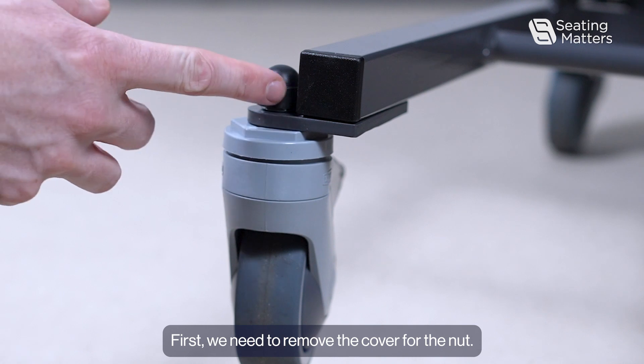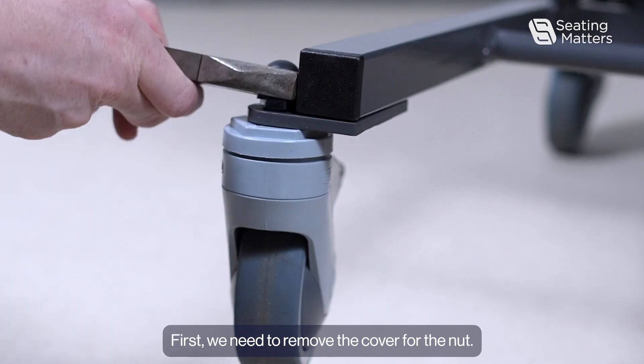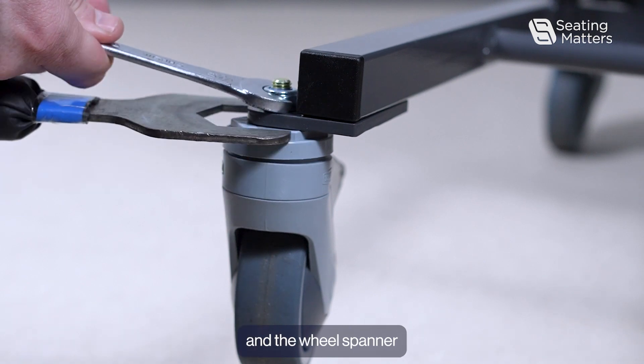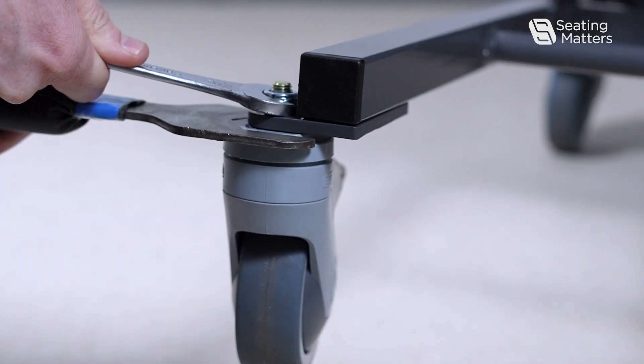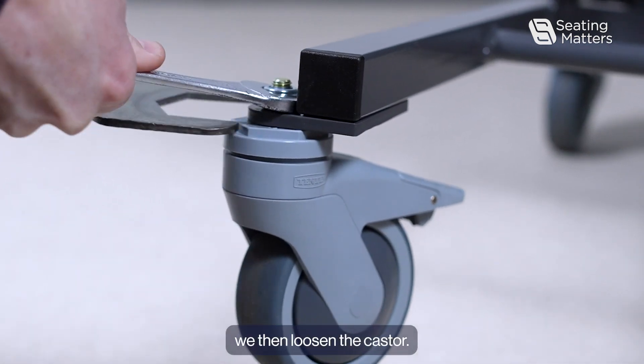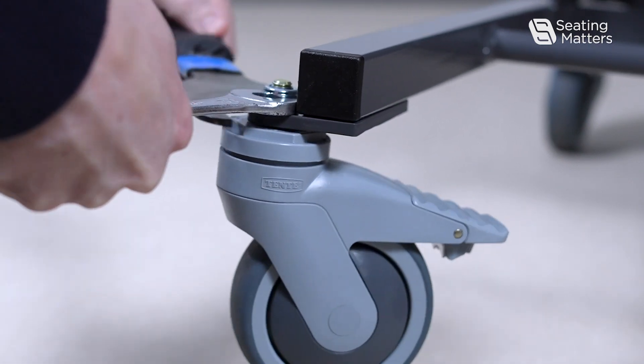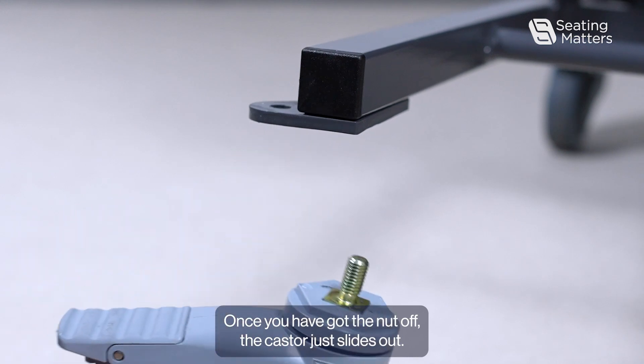First we need to remove the cover for the nut. Using the spanner and the wheel spanner, we then loosen the caster. Once you've got the nut off, the caster just slides out.